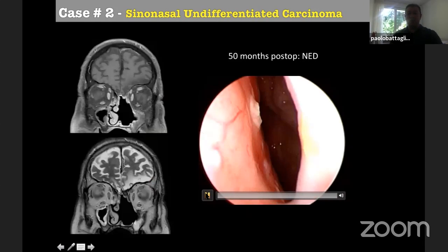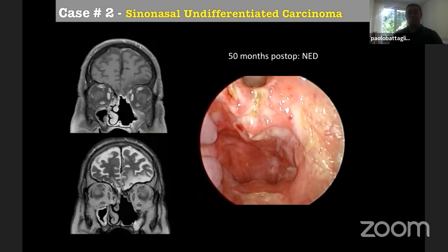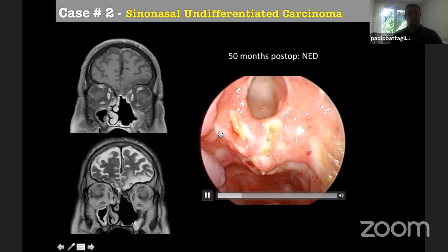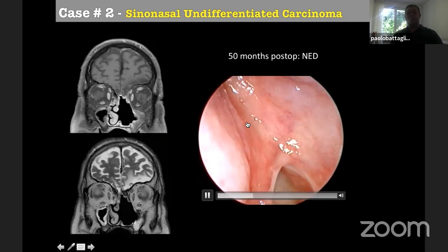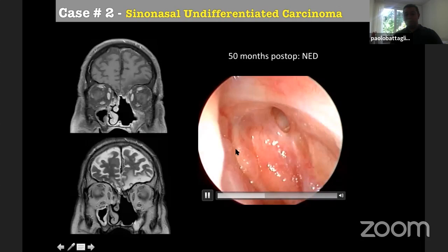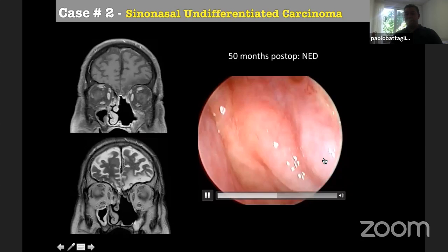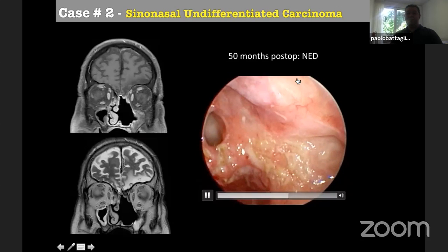But let's see what happened 50 months later. The sphenoid remains open. The right ethmoid is normal here. And in the upper part, you can see the contralateral olfactory cleft and olfactory fibers preserved, and the flap covering the anterior skull base till the orbit here.